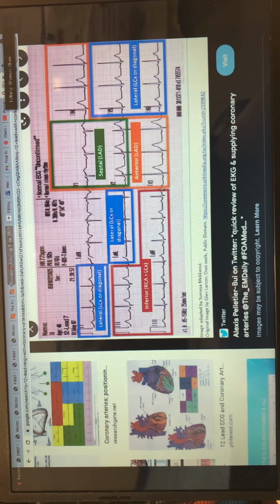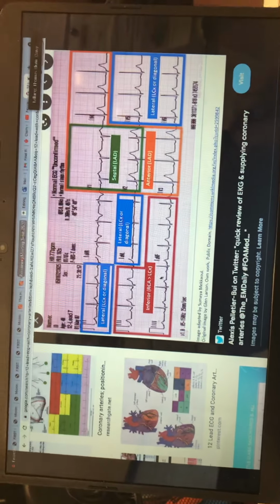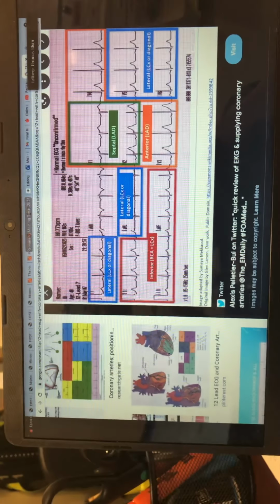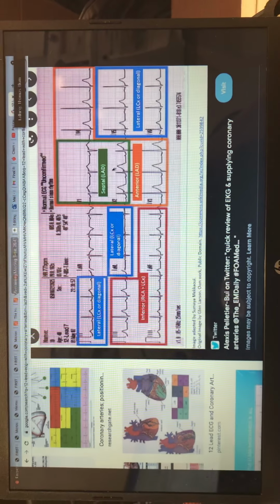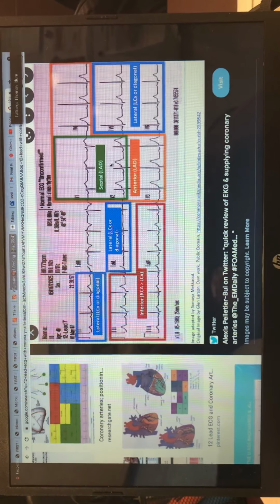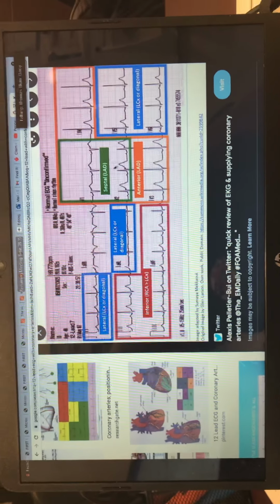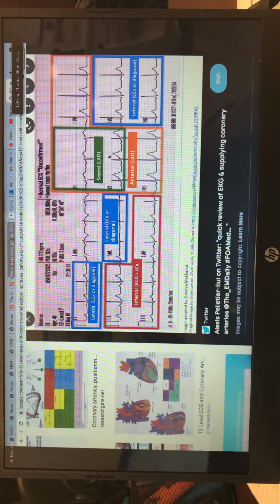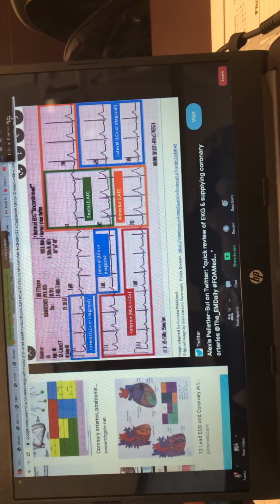So if I have a little bit of ST segment depression in V3, V4, okay, and I don't see reciprocal changes anywhere else, which is common because none of these are truly reciprocal views, I've got to move my leads to find those reciprocal views, which is your posterior view, your V7, 8, 9 essentially, right? So I'm taking 3 electrodes and I'm moving them to my back, right, to look at that posterior wall of the myocardium, where hopefully I'll find an ST segment elevation or depression depending upon what I have here, right? A true reciprocal change.